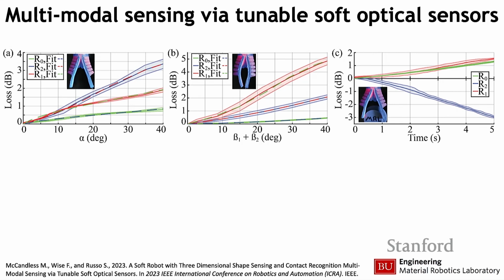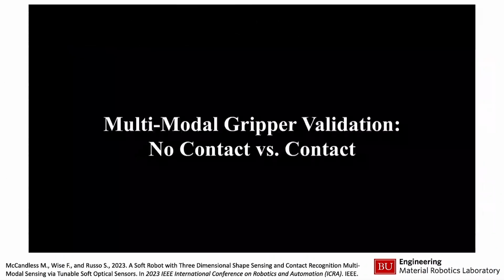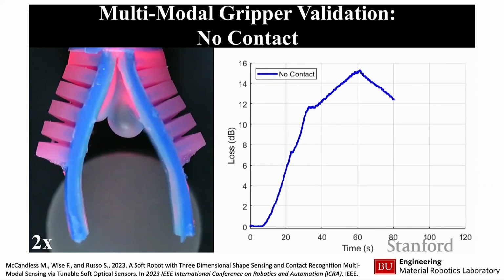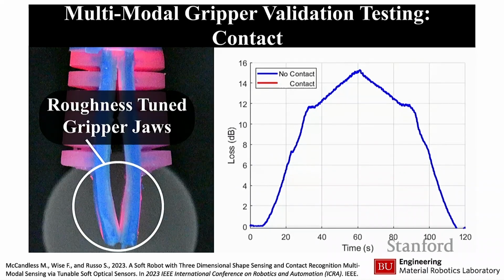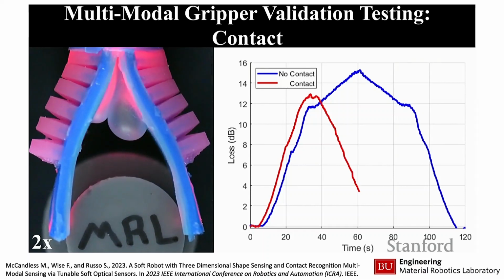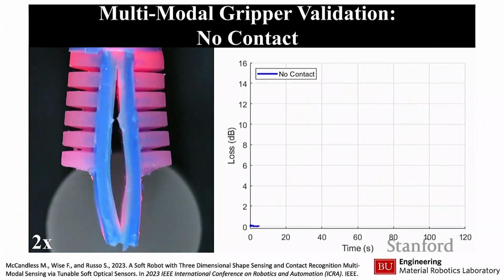And so as you can see here, when our gripper is moving, we're getting the response that we're supposed to be getting, but then as it's touching an object, we're getting a different type of response, and we can track that contact. And the cool thing about that is that you can track these two different inputs, and how you do that is basically, I want to show you a live plot of this. So as the gripper is deploying and opening, you have this type of response, but then if you have an object placed at the gripper jaws, you basically have a different type of response, which basically gets you that information that you're looking for, whether or not there has been contact, with just one sensor integrated.